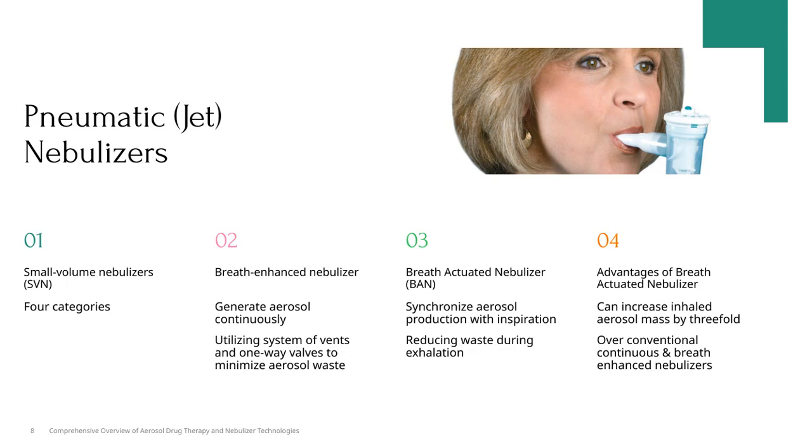Let's take a look at pneumatic, or jet, nebulizers. These devices generate aerosol continuously, which means they produce a steady stream of medication particles. To make this process more efficient, some systems use breath-enhanced nebulizers. These incorporate vents and one-way valves to minimize aerosol waste, ensuring more medication is delivered during each breath.